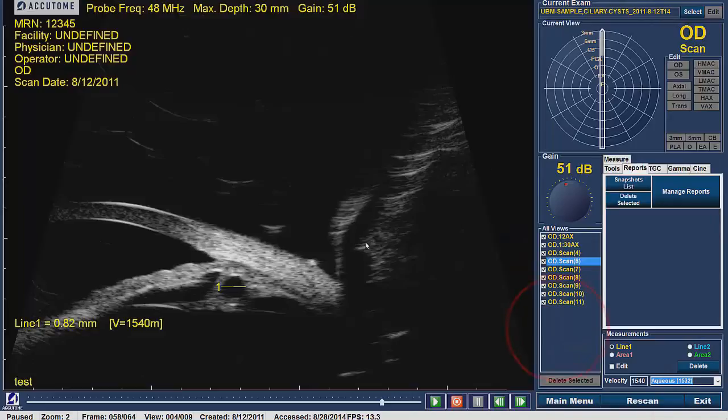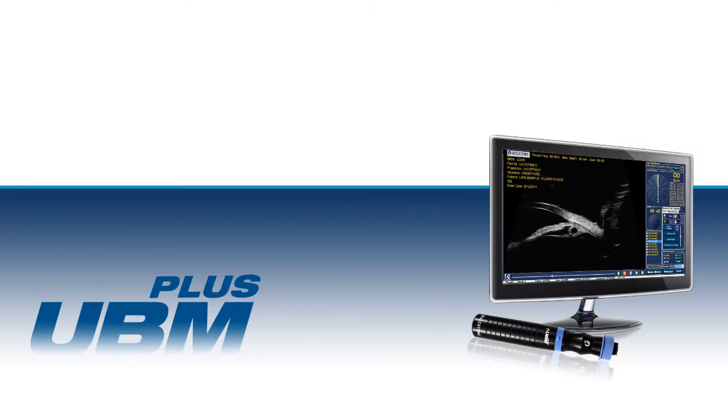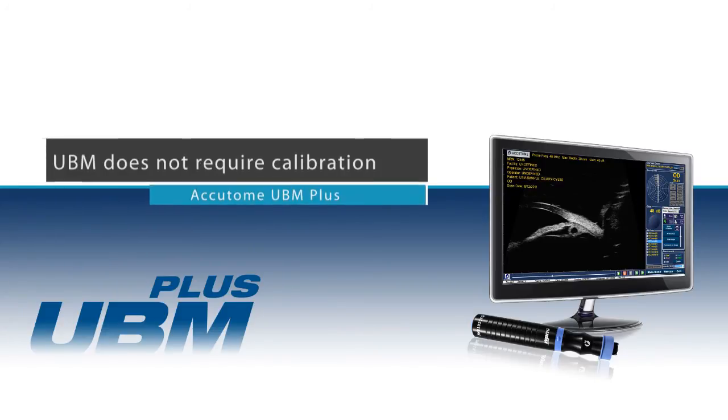To exit the patient's Analyze screen, click on Main Menu or Exit. This will exit the software completely. Calibration: the Accutome UBM Plus does not require any calibration testing.